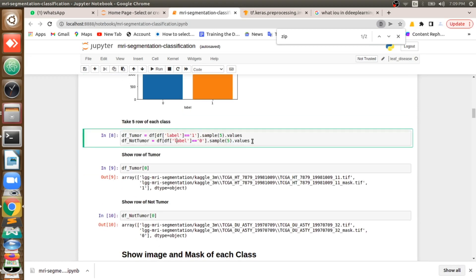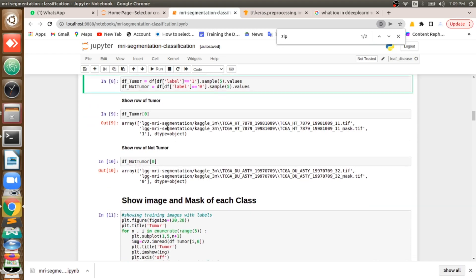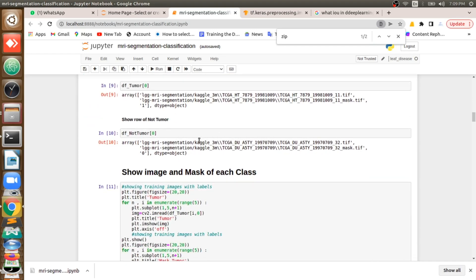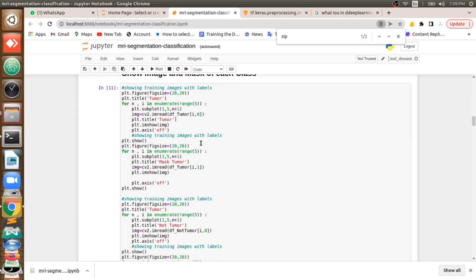Then I am splitting the data frame into two: df_tumor, which contains all image and mask information of tumored images, and df_not_tumor, which contains all information of non-tumored images with their masks. I am printing the first value of each so you can see their names printed here. Now I want to plot some images from each class: non-tumored brain images, tumor brain images, non-tumored mask images, and tumor mask images.